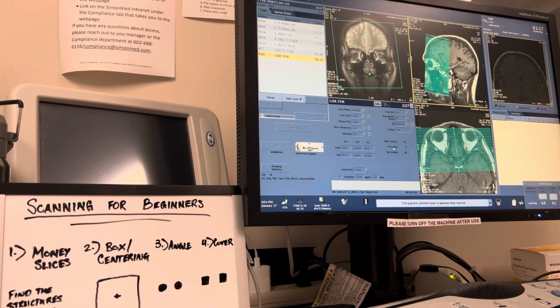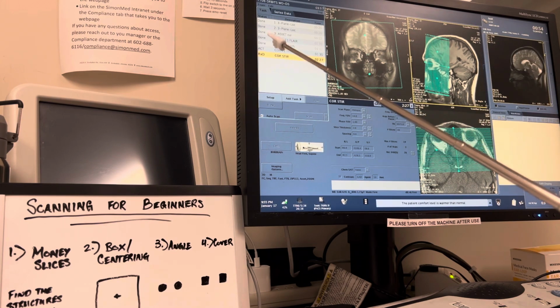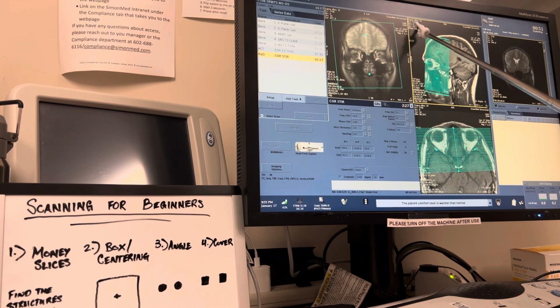The only thing you need to do now is, yeah, perfect. You need to check your images. Yeah, great job. And then keep in mind you have to check these 2 once we're done as well. Right? So keep in mind you always have series. Series 3 would be the asset calibration. Series 2, that's that localizer. Every single image has those. So that's how you can always tell which one's up. All right, great job.